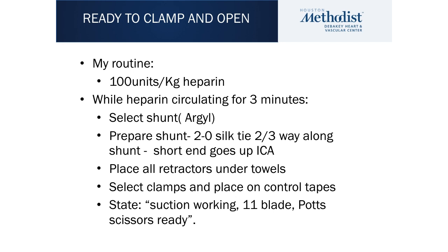We now have tapes around the external, the internal, and the common carotid artery. At this point in time, I tell the anesthesiologist to go ahead and give the heparin. We give 100 units per kilo of heparin, and we are going to let it circulate for 3 minutes.